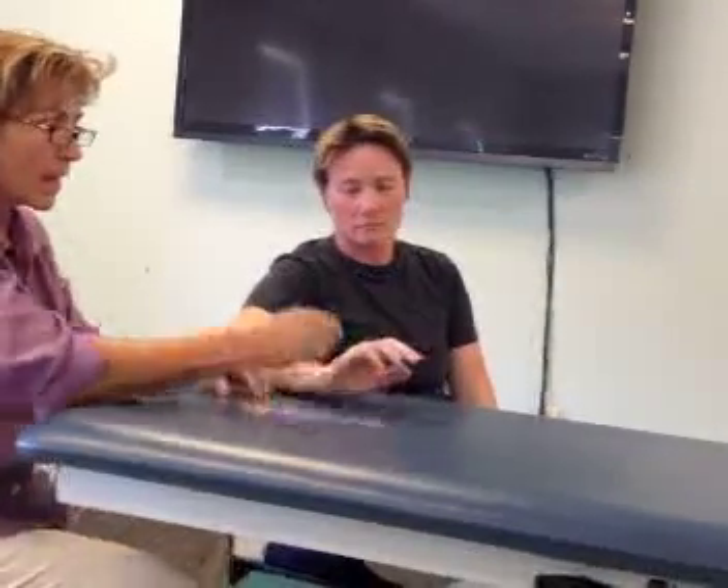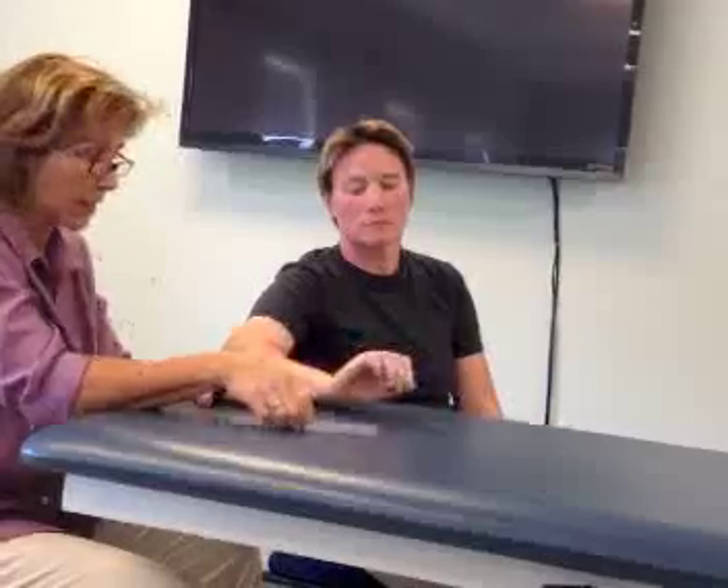Now this is the other thing — there's some tissue here. I'm saying it's your muscle, your flexor digiti minimi. That's what it is. You have to make sure you're not using that tissue as your landmark. It's got to be the bone that's the landmark. And do not use the pinky as the landmark — it's the metacarpal that's your landmark here.